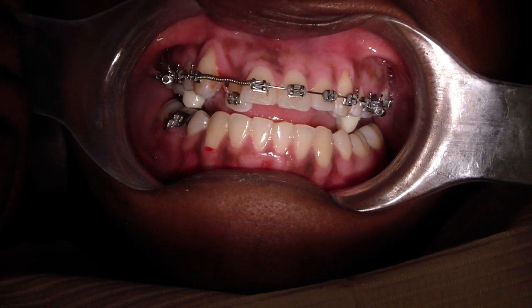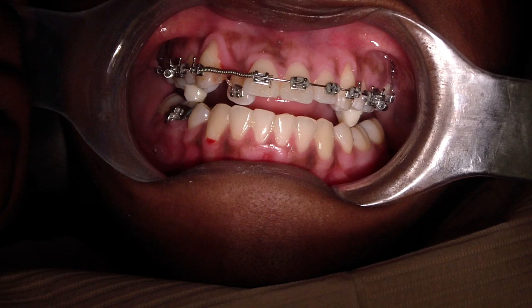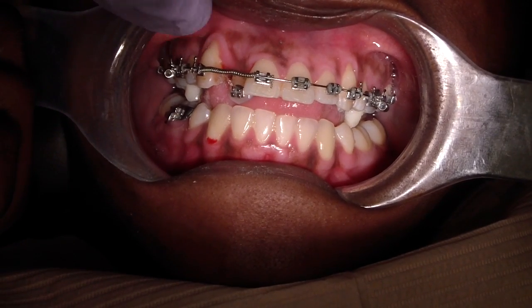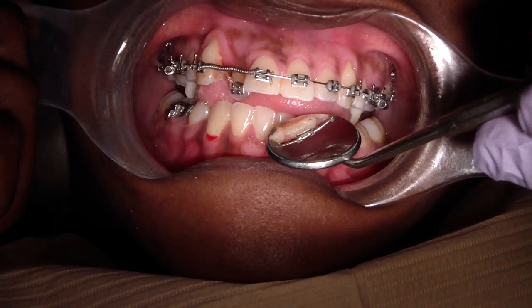Hey folks. This patient, a young lady, went on a vacation, now came back. She's actually been in ortho two times previously and had to be debonded for several reasons.